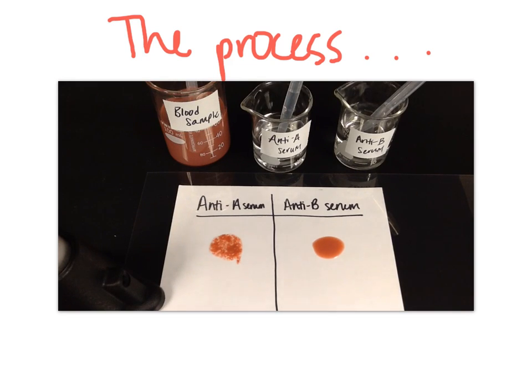So what you look for in blood typing is you look for the clumping, what we see on anti-A. If there is clumping, you would record a positive on your sheet. If there is no clumping, you would record a negative. Whenever you see clumping, that's what tells you what blood type they are. So this person would be a type A blood type.